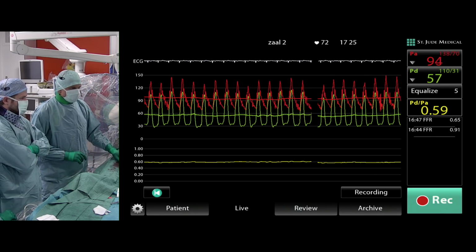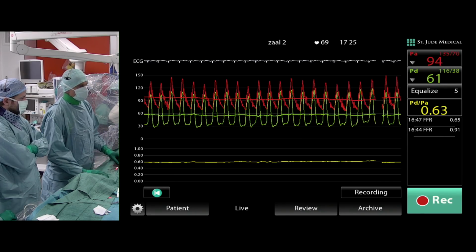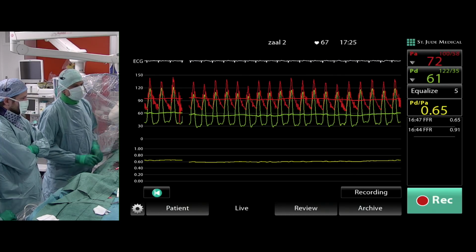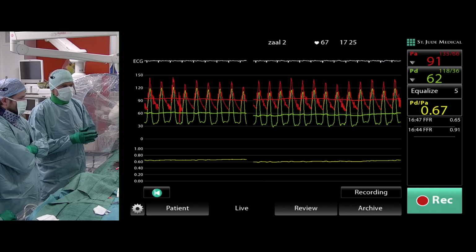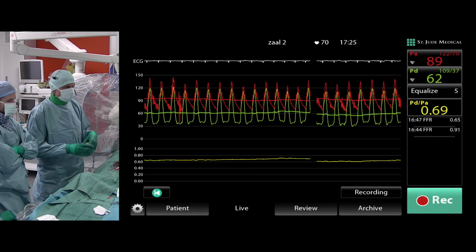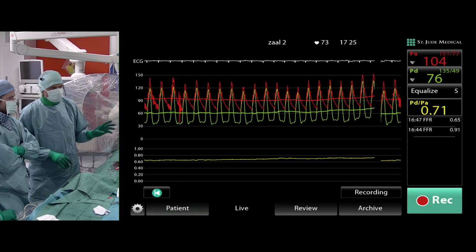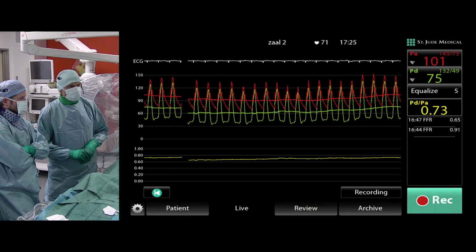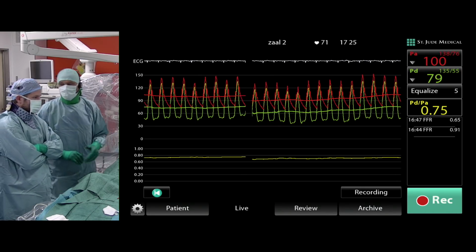And you see that it lasts really long, a little bit longer than I would have thought, to be honest. And now it's coming back. It's already 1 minute, almost 1 minute. But this is simply the proof that even if you use an intracoronary agent, it is possible to do a nice pullback. And this is what we are going to demonstrate now. We're going to wait another 30 seconds to let the Pd recover its baseline value, which is happening now. Okay? And now, Gabor, we will not forget to push on the button to record.